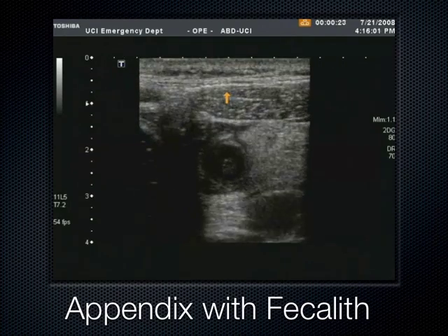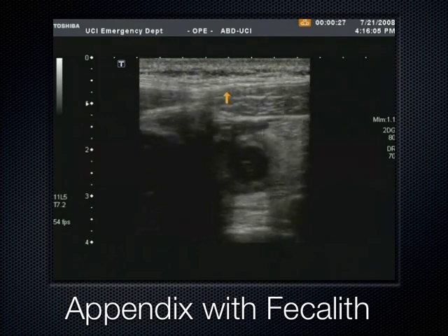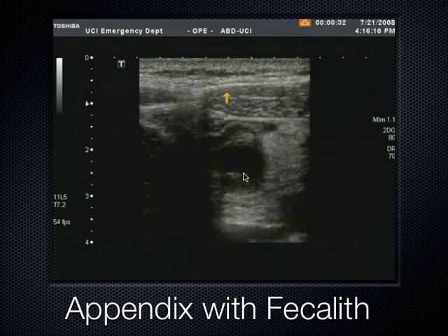This comes up all the time with the gallbladder. People go, oh, what's that thing over there? What's that mass in there? And it's just the duodenum seen on end sometimes, and it can look a lot like this. It looks like any other part of the intestines. We'll get to that in a minute.